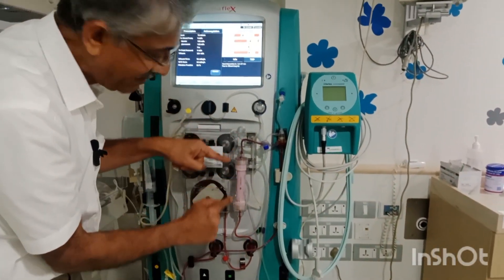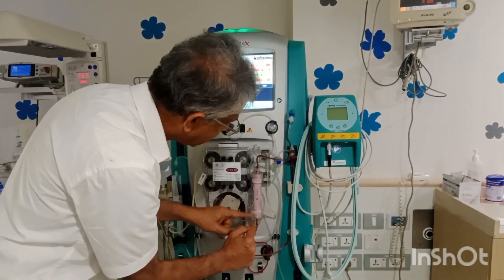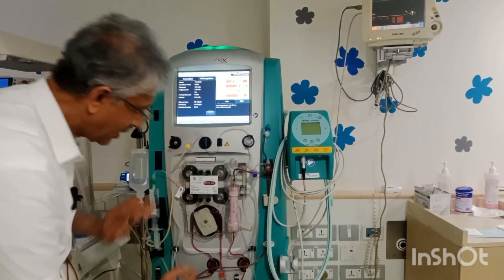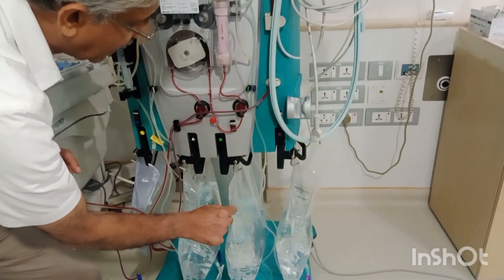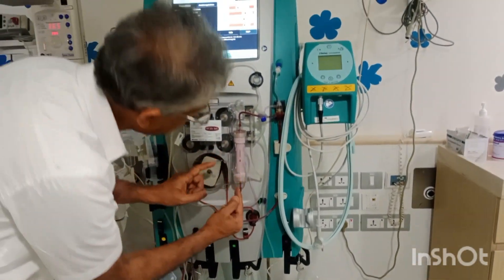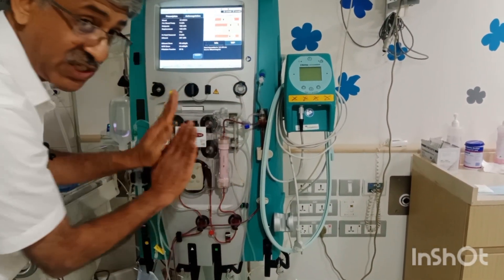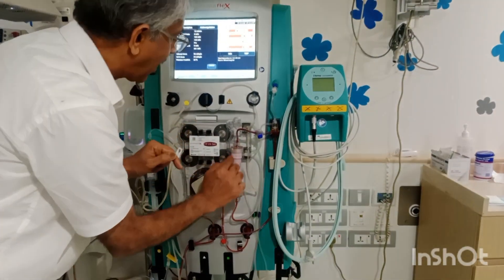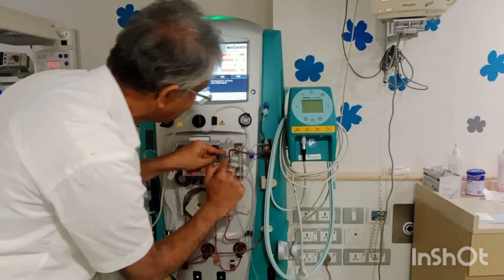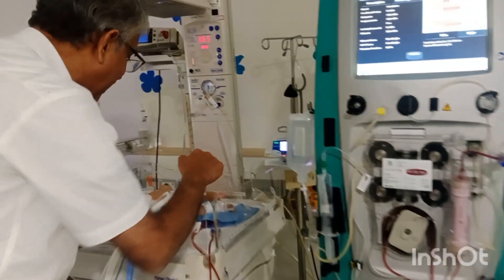After that, it goes into a filter — you can see the filter here. This filter is very important, and this filter is also connected: one side receives blood from the baby, and the other side has the dialysis fluid, which you can see here, and this is also connected to the filter. The blood enters to the center, and peripherally this fluid flows, and the exchange of solute happens. After that, the blood comes to the venous system of the baby — you can see it coming down and going into the umbilical vein.